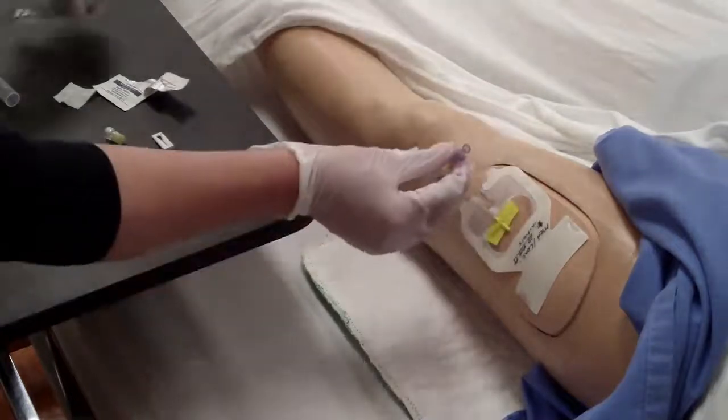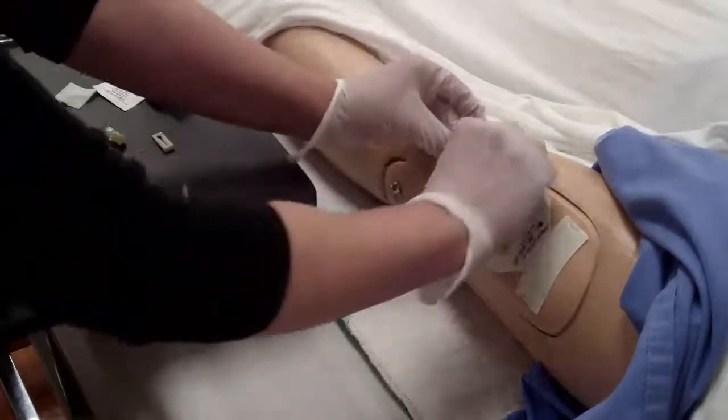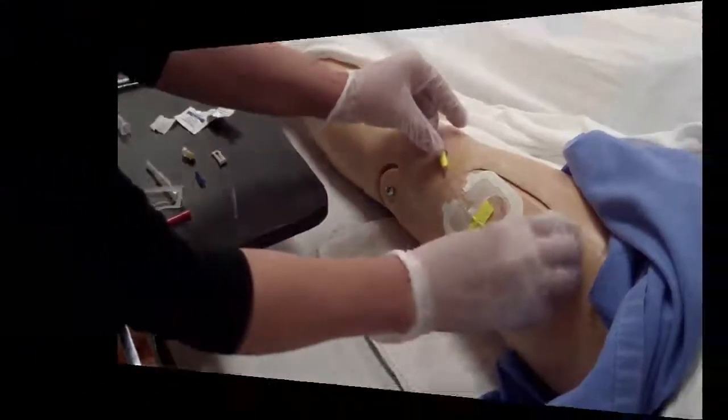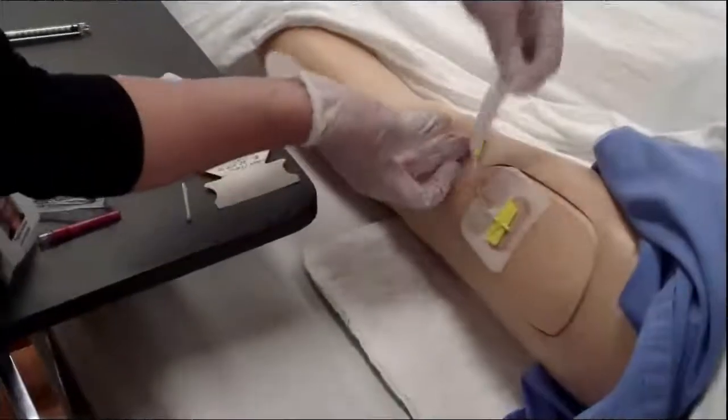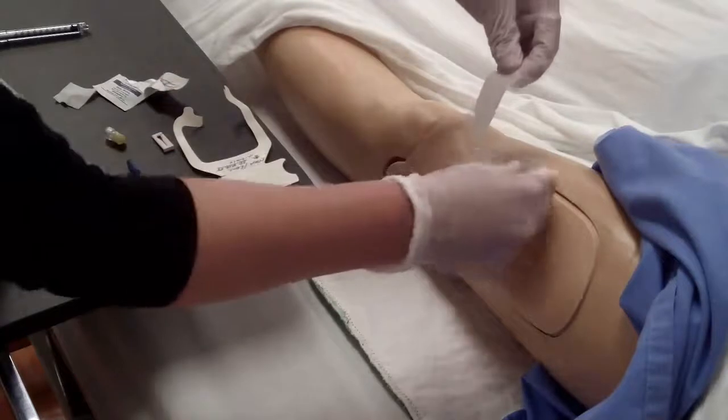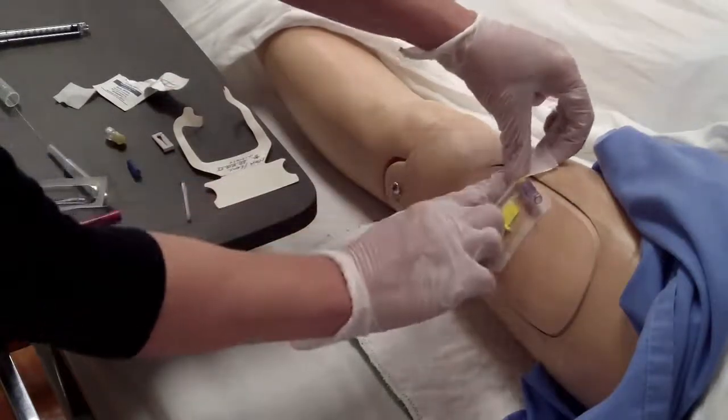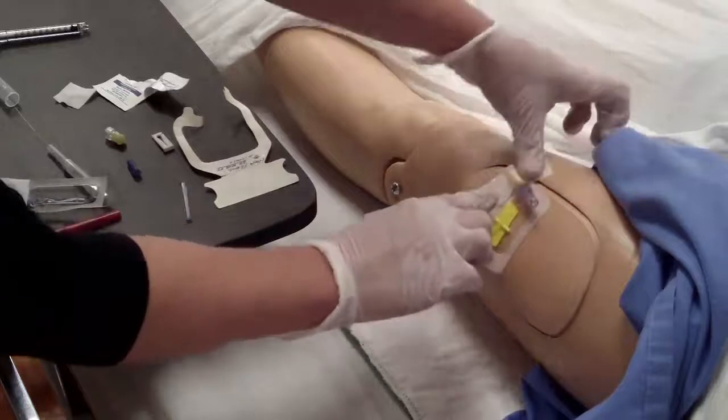When you have administered the medication, you can remove the syringe. Remove the rest of the backing from the dressing and use the tape provided on the dressing to secure the line.